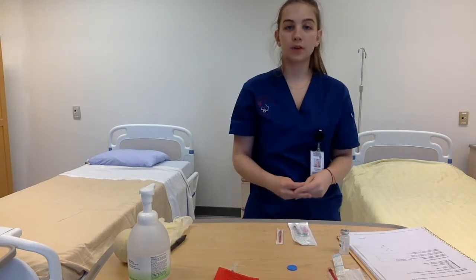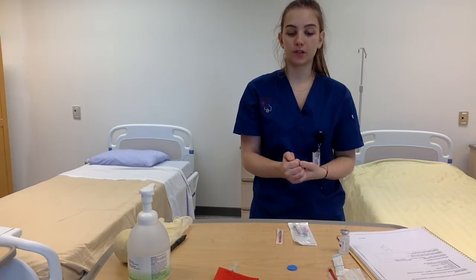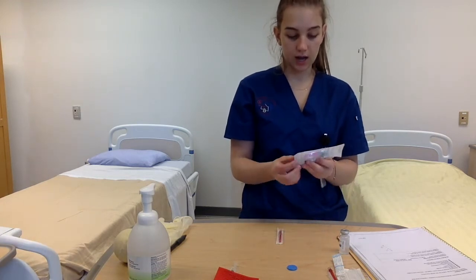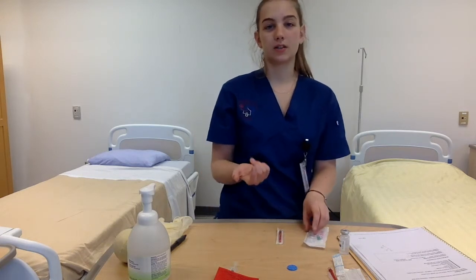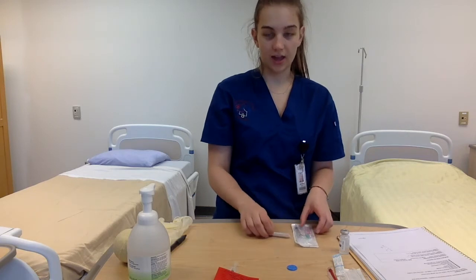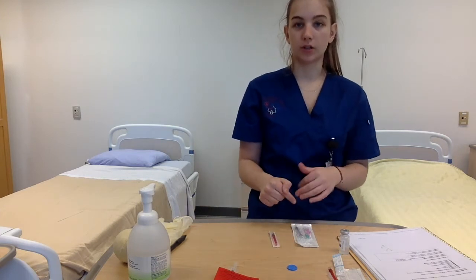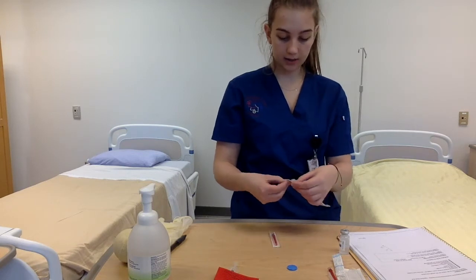Okay, so now I'm going to be preparing the IM medication for Mr. Mancini, so I'm just going to be getting this one ready next. So for this medication, I have chosen to use a 21 gauge needle because it's an IM injection, and Mr. Mancini is of average weight, so this is adequate to get to his muscle. And then again, I just have another blunt tip for drawing up the medication from the vial that I'm going to use first, as to not damage the needle that is going into the patient. So I'm just going to open up my supplies.